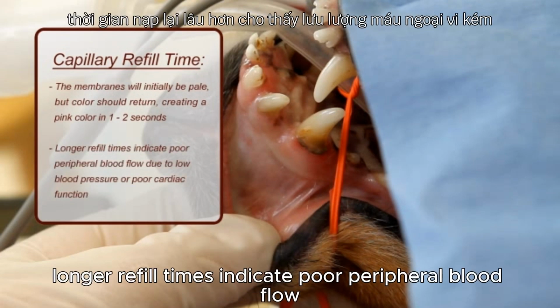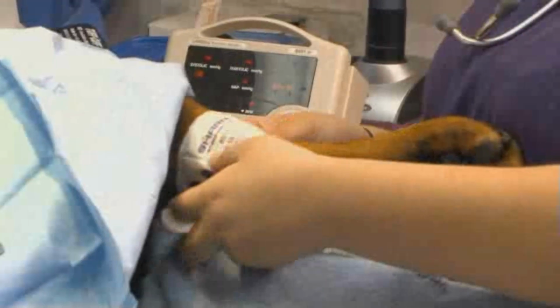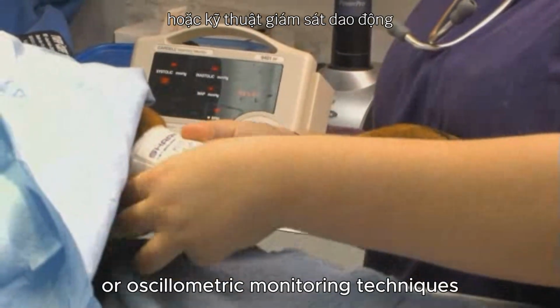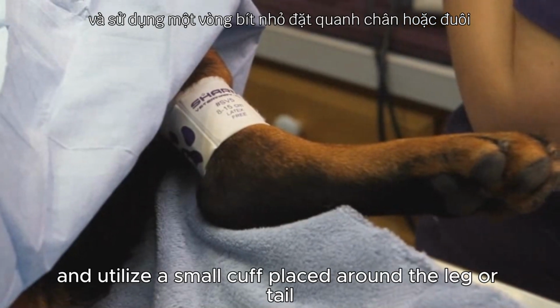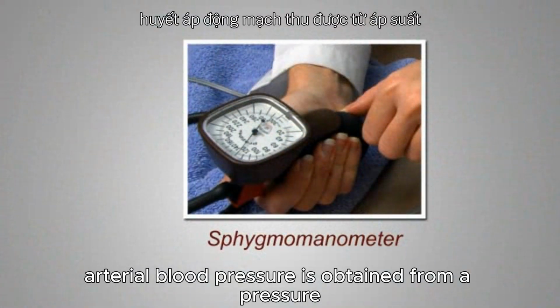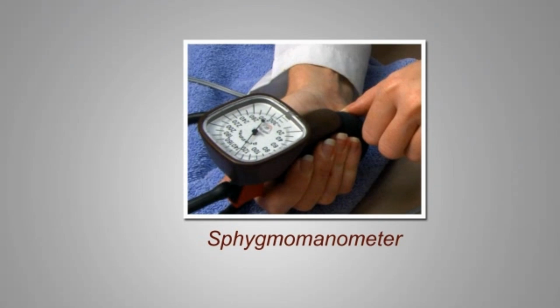Longer refill times indicate poor peripheral blood flow due to low blood pressure or poor cardiac function. Blood pressure can be measured in many patients by using Doppler or oscillometric monitoring techniques. These techniques are non-invasive, indirect, and utilize a small cuff placed around the leg or tail. Arterial blood pressure is obtained from a pressure gauge, a sphygmomanometer.